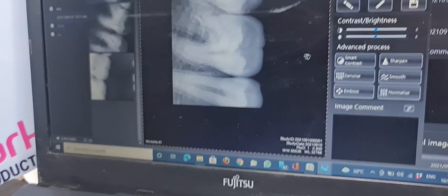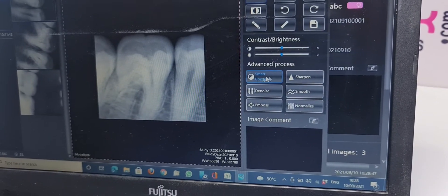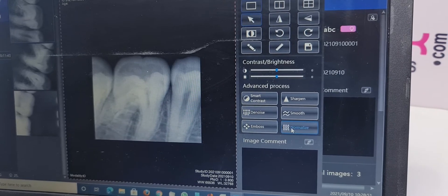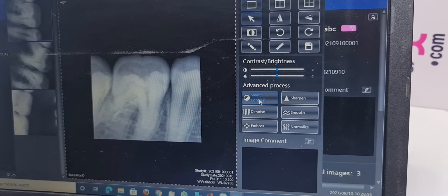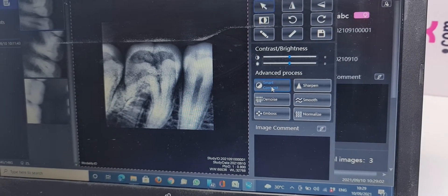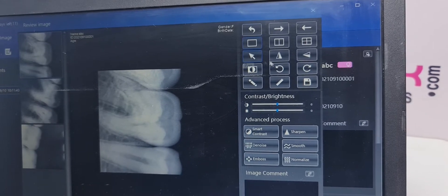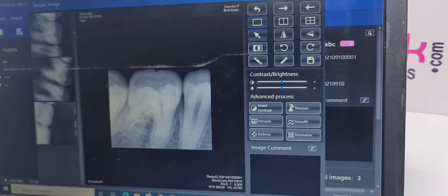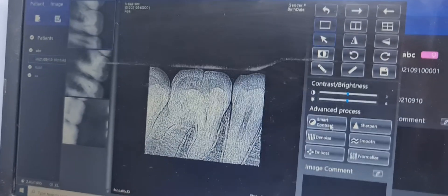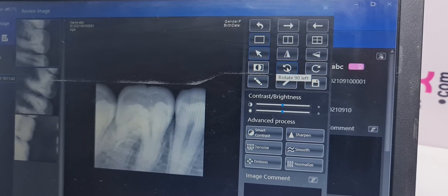Double click to change the position. Here there are settings: smart contrast, emboss, normalize, smooth, sharpen — anything you want to do. The more times you press, the more effect is applied. If you want to reset it, you can reset it back to the original position. For example, apply sharpen. All the settings you can do according to your requirement.